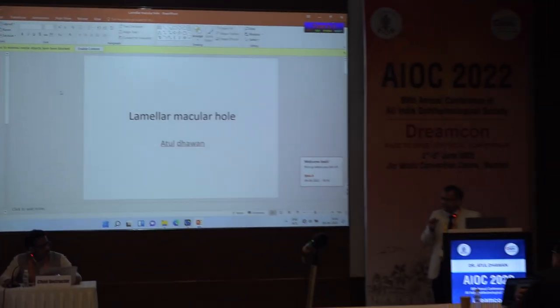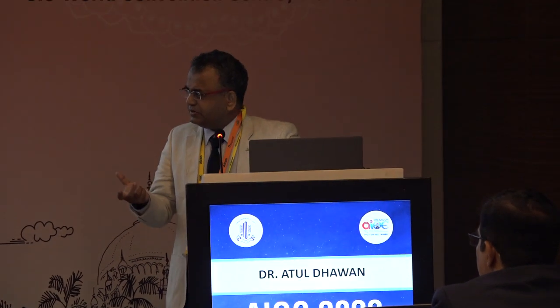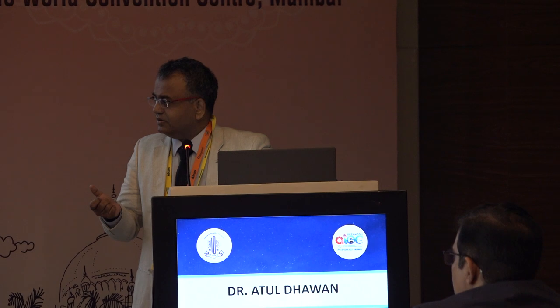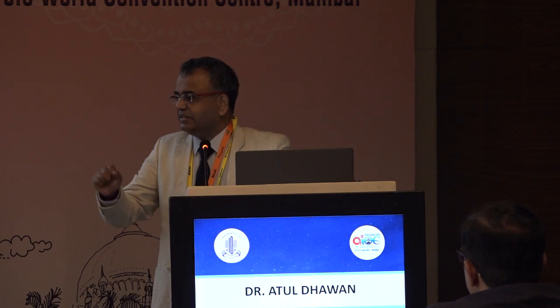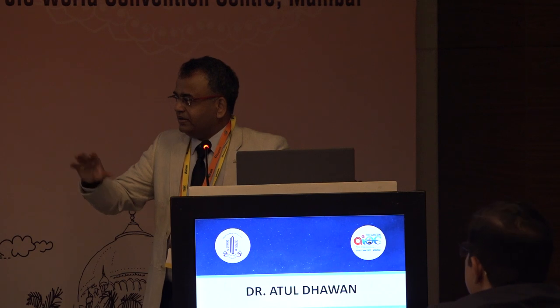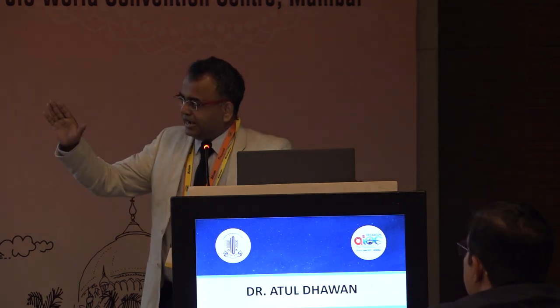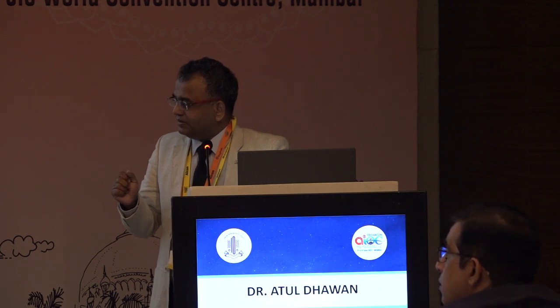If the hole is very small, I have to inject inside the eye, in the subretinal space. So your assistant is injecting? No, I am doing only. Okay. The oil bubble is coming spontaneously near the hole, and you are actively aspirating the hole by extrusion. No, first of all, if the oil is there, I have injected the BSS, the oil will come in the superior part. Okay. With the help of the silicon tip cannula, I am sweeping it towards the side of the hole. And then you are actively aspirating it.